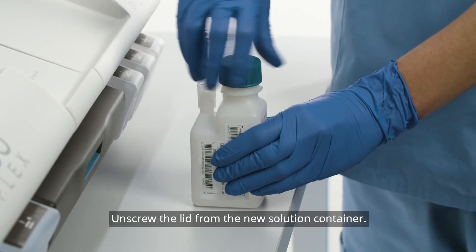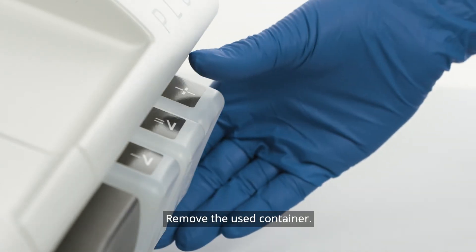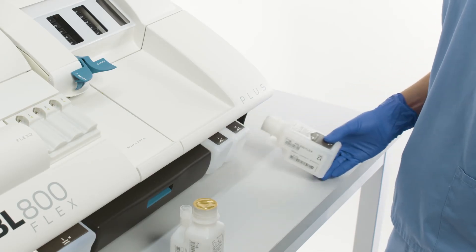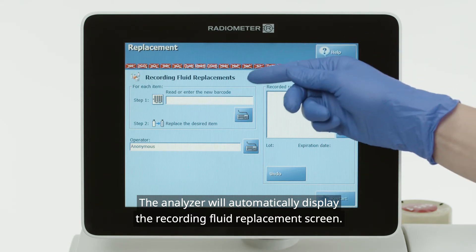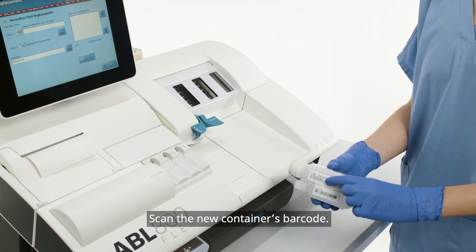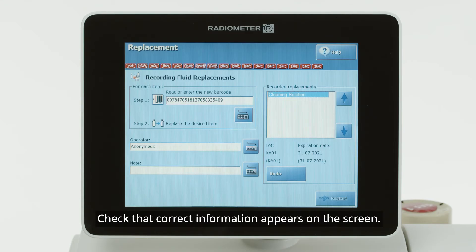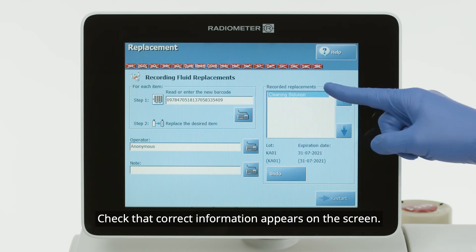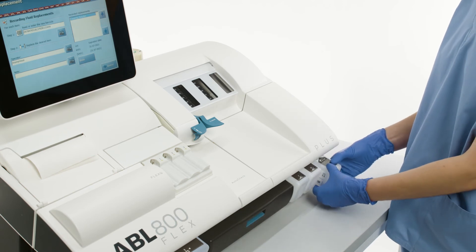Unscrew the lid from the new solution container. Remove the used container. The analyzer will automatically display the recording fluid replacement screen. Scan the new container's barcode. Check that the correct information appears on the screen. Place the new container into the analyzer.